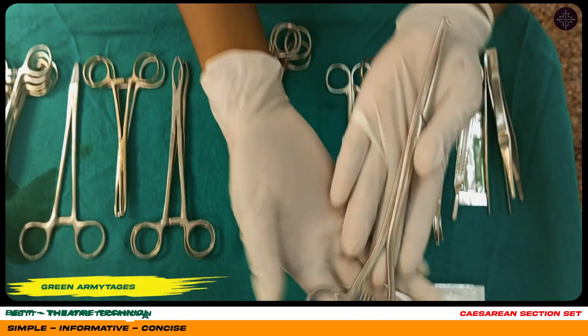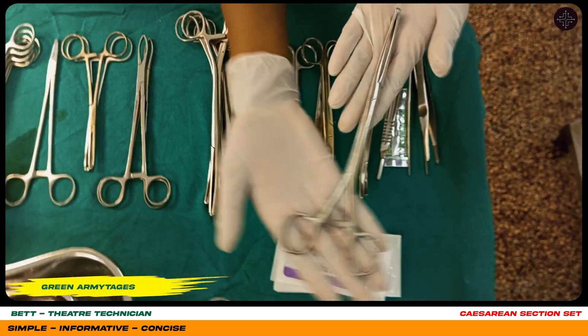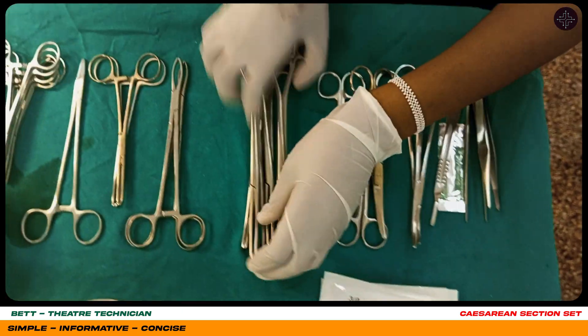Here are my green haemostats, as you can see. This is a green hemostat. We have five here.